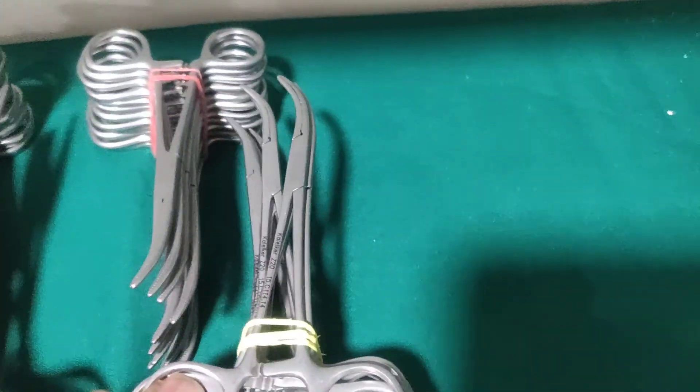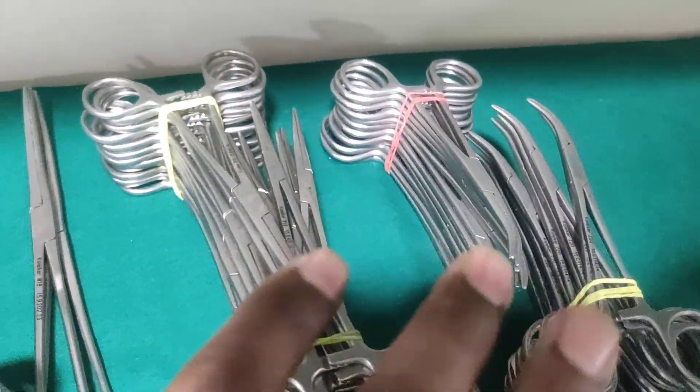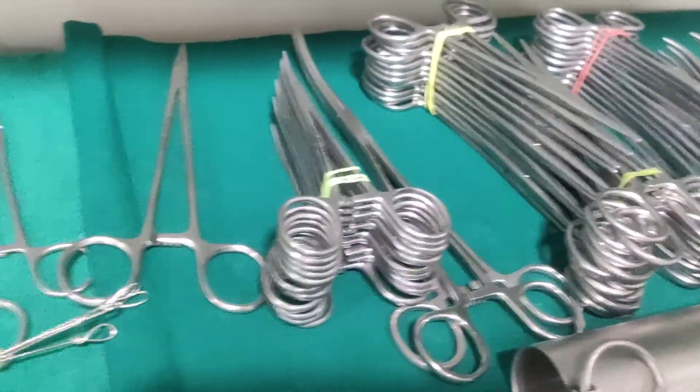And it's 24 pieces? Yes, 24 pieces. So straight artery is 24 pieces? Yes, 24 pieces — that's what it looks like. The muskido parts.